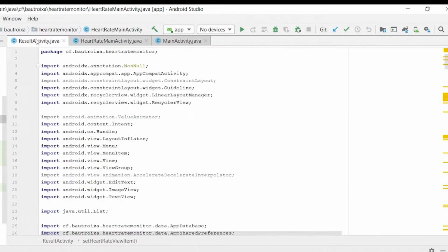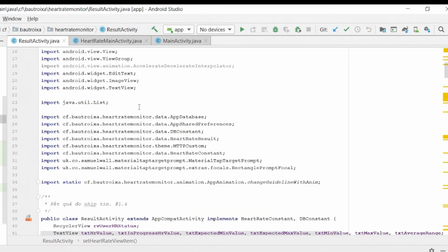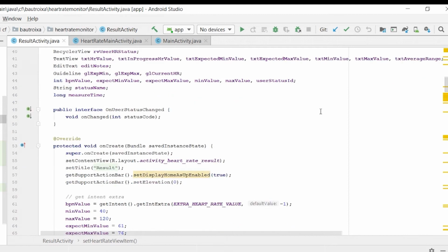Now let's take a look at the code for the ResultActivity.java. The following packages that are imported for the current file are shown here. Here we have made a public class ResultActivity.java that extends AppCompatActivity and implements the database and the heart rate constant. The beats per minute, expected minimum value, expected max value, minimum value, max value, and user status ID are the integers used for the calculation accordingly.